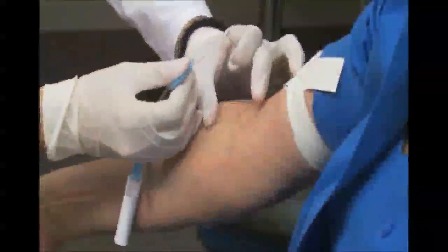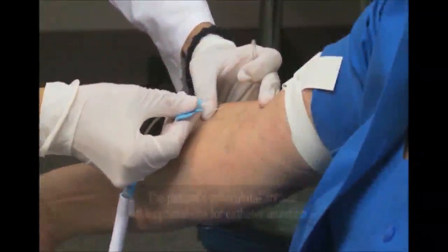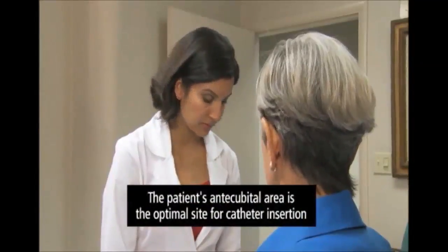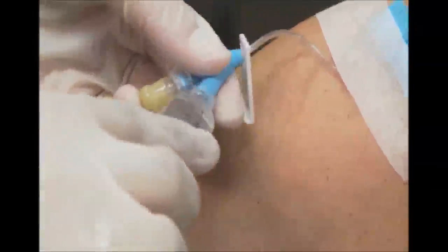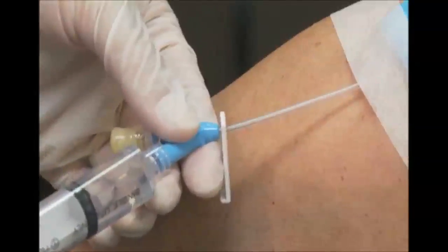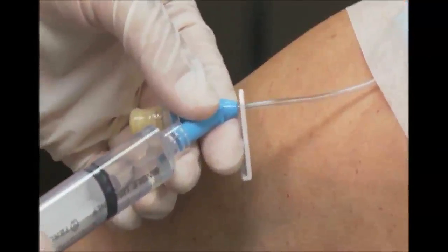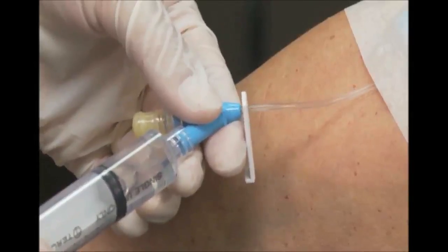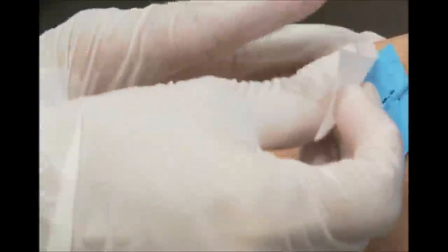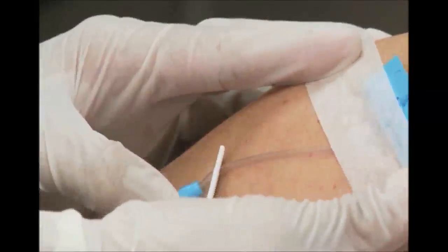Now place a catheter into a vein in the patient's arm. It is strongly recommended that the largest arm vein possible, preferably the antecubital, be used for injection. Next, remove the catheter needle and check for blood return with one of the two syringes containing 5 mL of D5W. If blood is present in the line, flush the line with the remaining D5W to check for patency. Secure the IV system with tape.